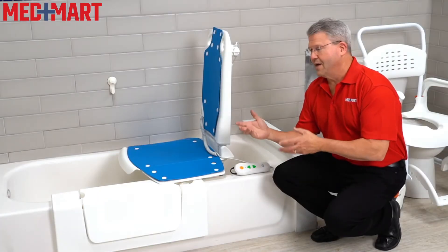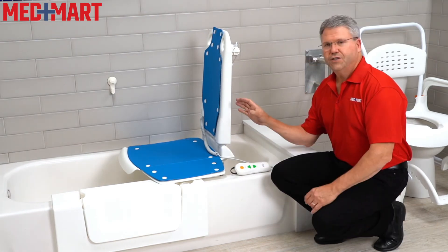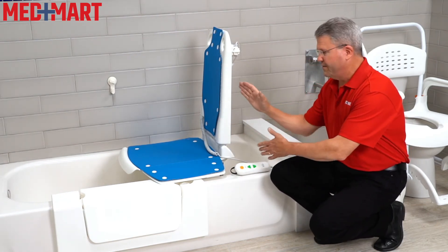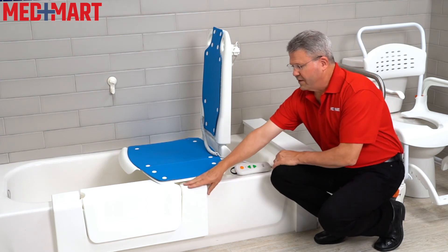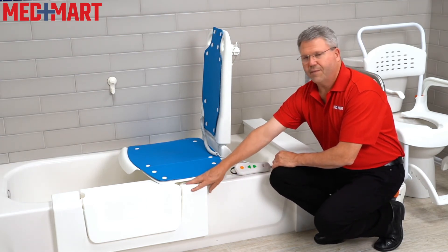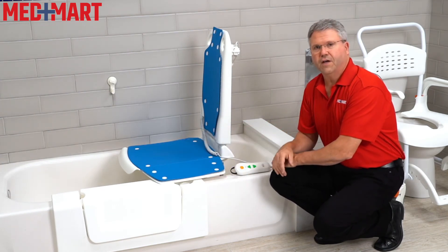Now let's take a look at what it's like to have the bath lift actually in the tub and a few things to consider when placing it. Always be aware of how much space you have in the back, because when you go to recline, you need to be able to fold it back to almost a 45 degree angle, so you need a little bit of forward space in the tub. It will sit along the smooth side of the tub, just like that.